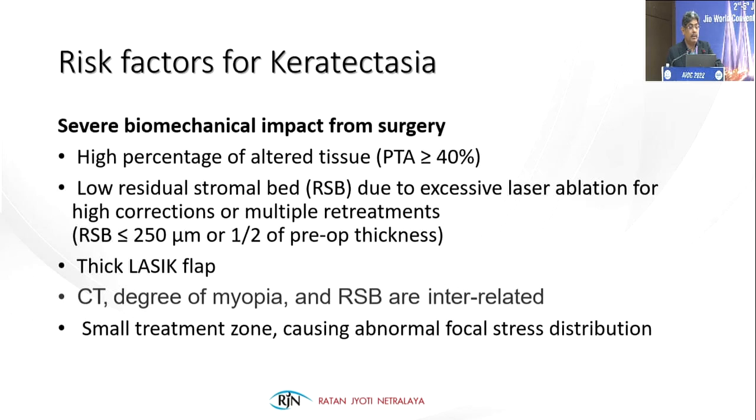A residual stromal bed of less than or equal to 250 micron, or half of the pre-operative thickness, is a red signal. Thick LASIK flaps, due to some problem with the blade or our microkeratome, can also be an issue. We may have planned a flap thickness of 120 micron but created 160 or 200 micron. This can lead to problems. Corneal thickness, degree of myopia, and residual stromal bed are therefore interrelated.